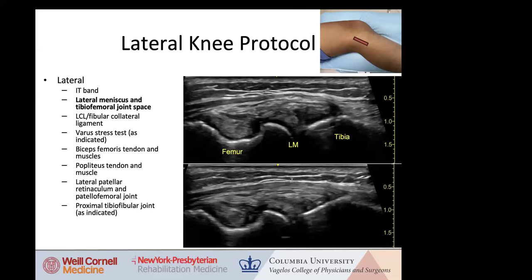Other things that you did a great job on, I think, the popliteus is challenging, and you mentioned in a couple of different structures, really trying to adjust your transducer positioning to bring out the best image you can possibly get. I think the popliteus is very susceptible to artifact, right?